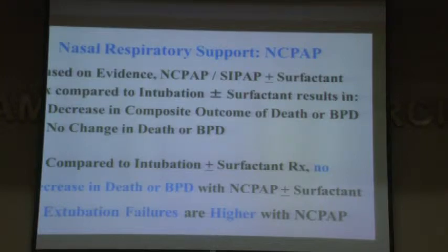However, nasal CPAP with or without surfactant therapy has not decreased the incidence of bronchopulmonary dysplasia, or BPD. Why? No matter where CPAP is done, which country, which part of the world, extubation failures or CPAP failures are much higher in babies, especially smaller babies. So the babies end up getting intubated or re-intubated. That's the reason you do not see a significant decrease in bronchopulmonary dysplasia in babies on nasal CPAP.